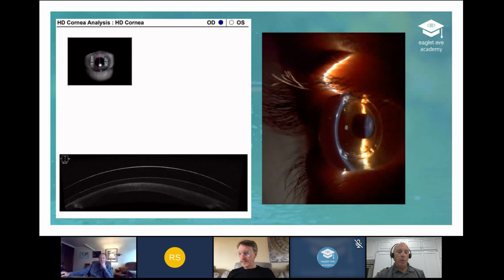But we noticed that, a couple of years ago when I started making lenses like this much differently than I had in the past, one of the consultants asked me one day, he goes, "Doc, we're noticing your fits are very different from everybody else's and very different than they used to be, but we also noticed you're not reordering lenses, and about half your lenses are one and dones. And the second are just minor things, maybe minor changes in powers, and that's the Eaglet really can get you to that point."